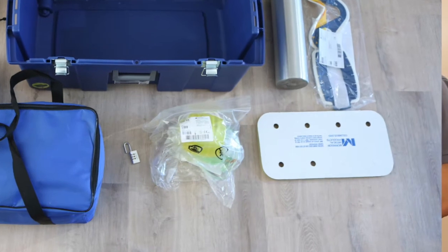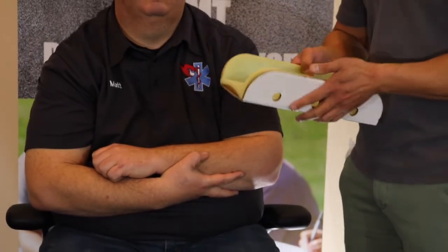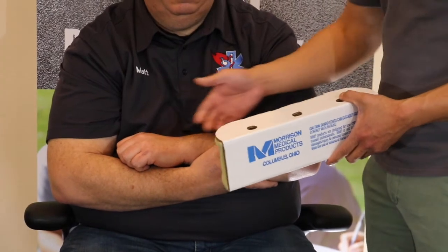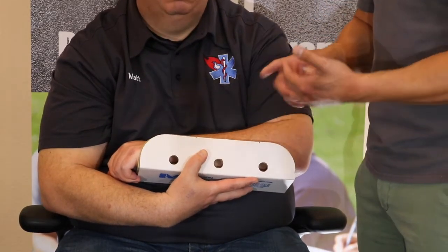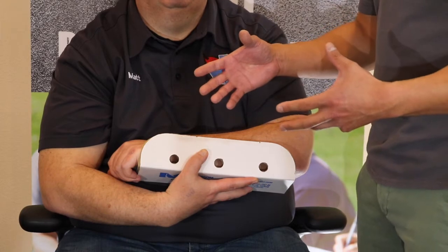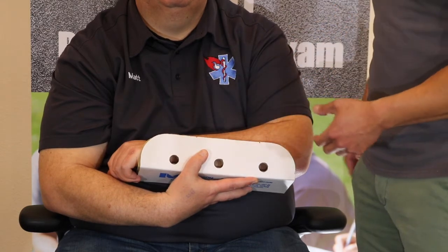Another option for splinting is cardboard splints. A lot of agencies still use these because they're an affordable orthopedic adjunct — literally just a piece of cardboard with foam glued to one side for patient comfort. They come in multiple different sizes. Some limitations to be aware of: because it's a paper product, if it gets bloody or wet, the splint can lose structural integrity. Also, depending on what you're splinting, you may need to pad voids that aren't touching the extremity.